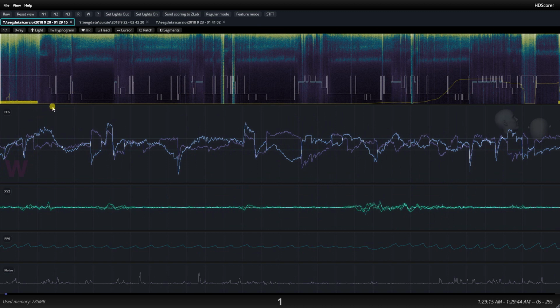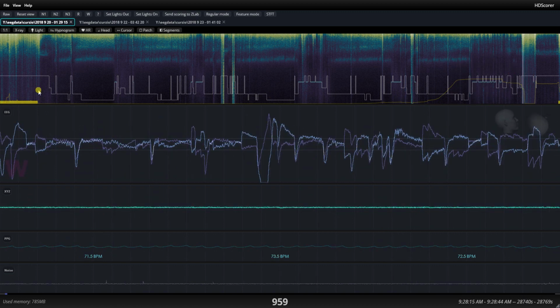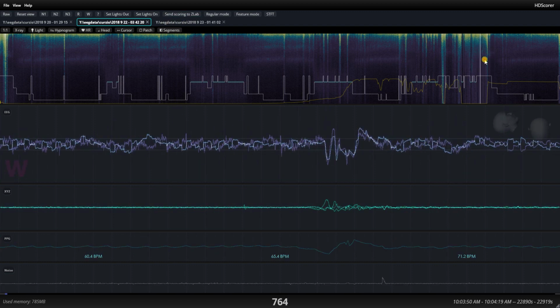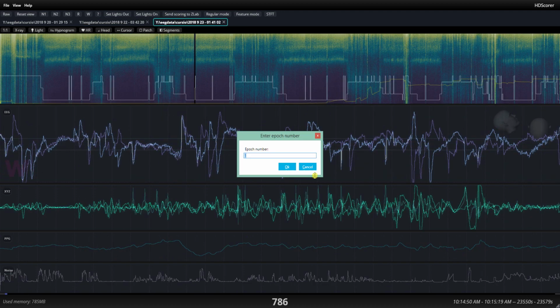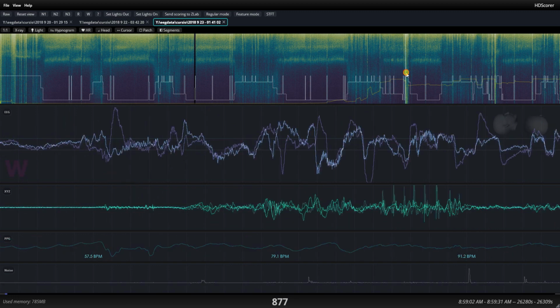But as you know, this yellow line is just a light. In fact, you can see here towards the morning, towards 8:30, we got a full light, and this is the light off period. Lights on. Let's see, the second night, probably this is some restroom break, and then on the third night, nothing special to see here. Again, at around 8:30 it became really bright.